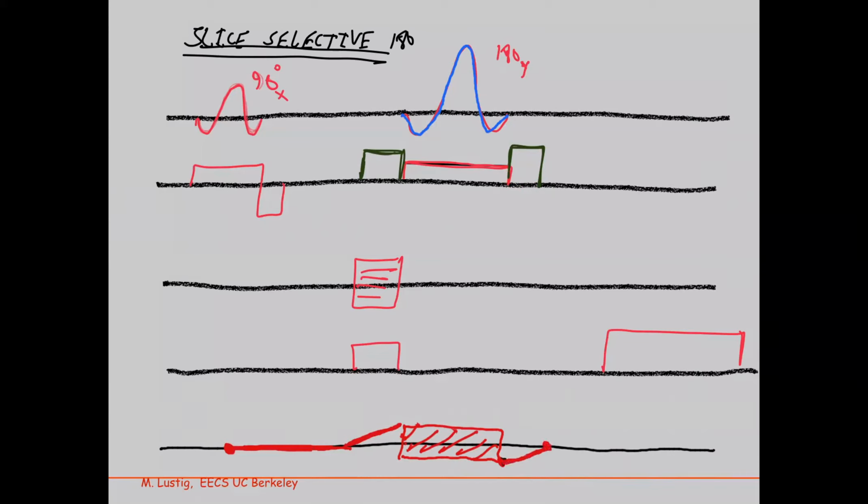And so the phase of this echo is going to be refocused at this point. So the fact that I put a positive gradient over here before the 180, for spins after the 180, it counts as negative. And you have a positive gradient here, and a positive gradient becomes negative after that. So they cancel. So the effect of this gradient and this gradient cancels for this excitation. It basically does nothing. Completely transparent. So spins go as if these do not exist. Okay, and then you continue on.